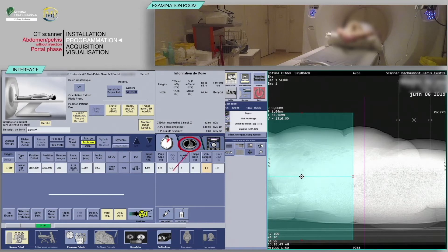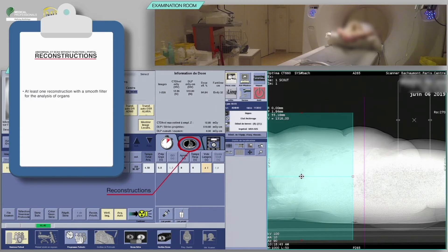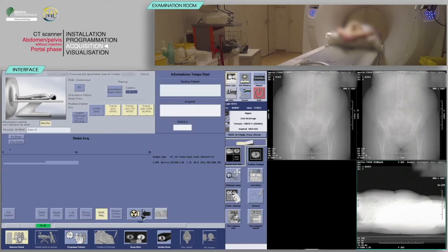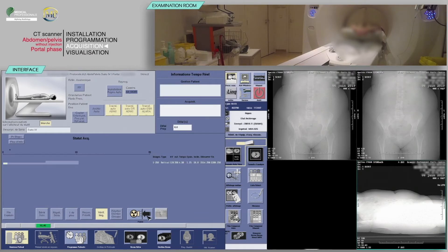Check the reconstruction boxes. For the acquisition of the abdomen CT, there should be at least one reconstruction with a smooth filter for the analysis of organs. Next, click on Confirm. On the keyboard, move the table and proceed to the acquisition when the buttons flash.